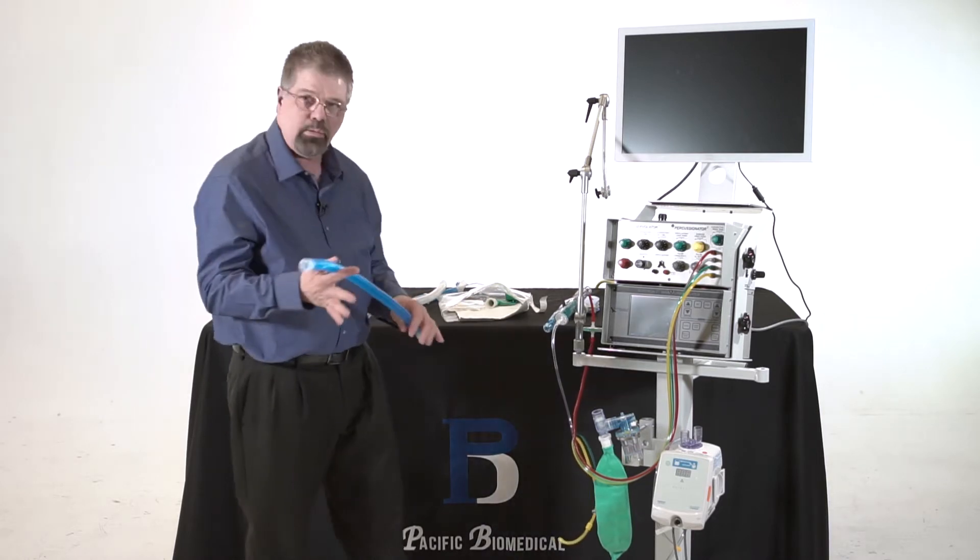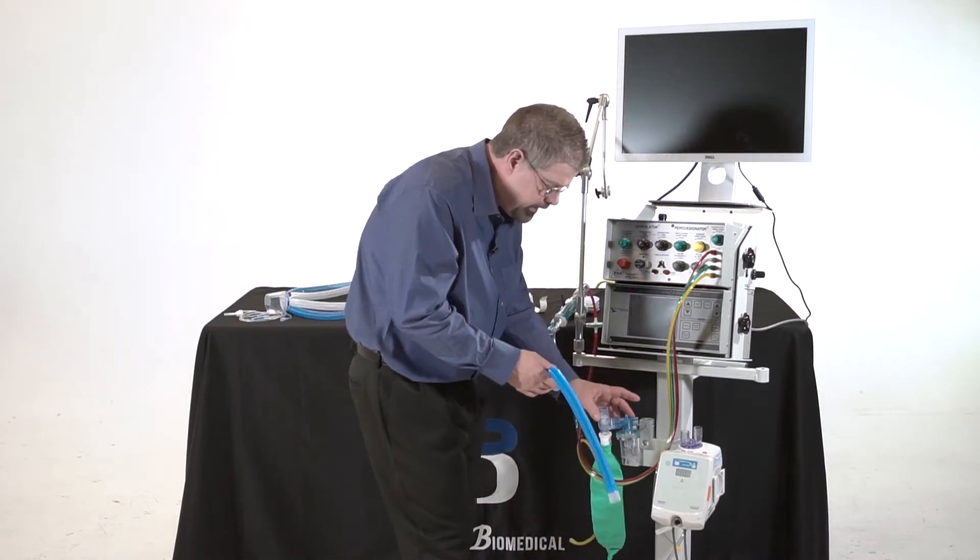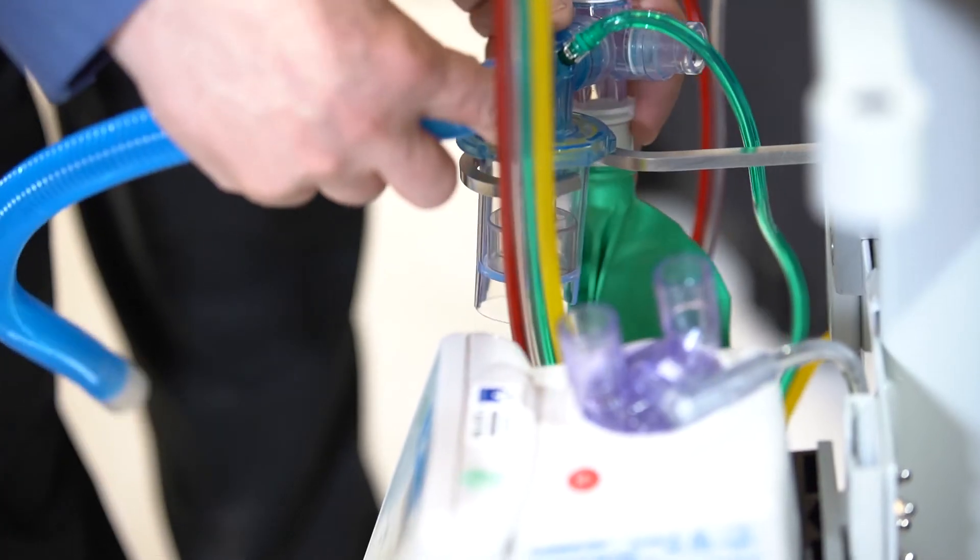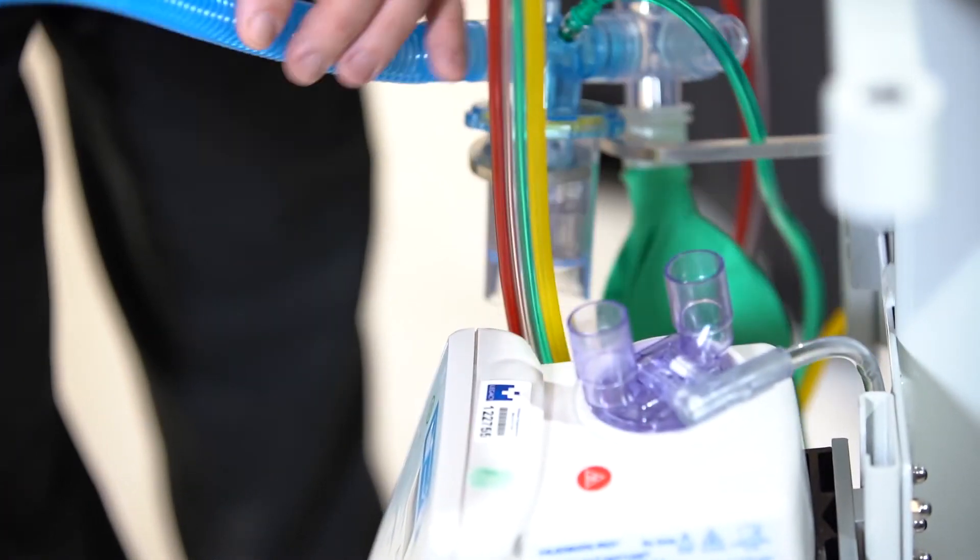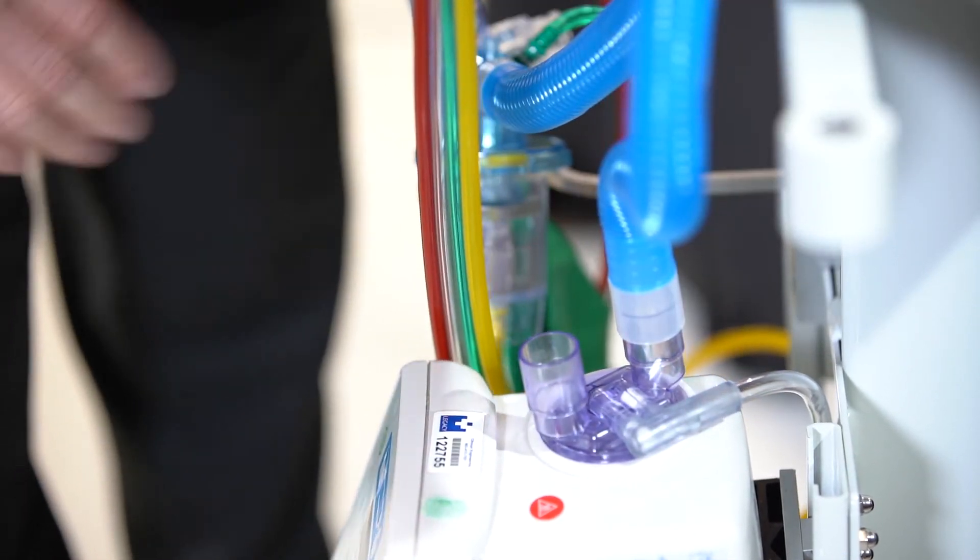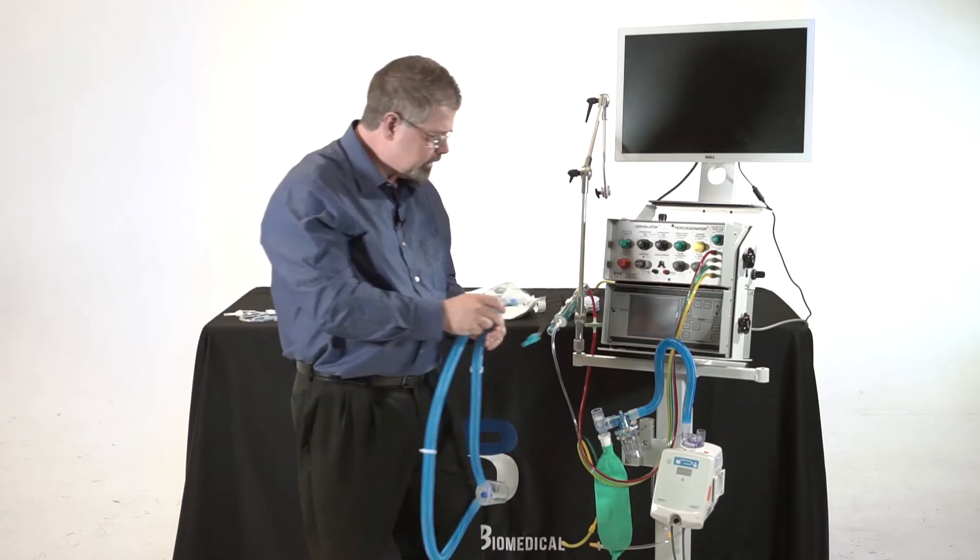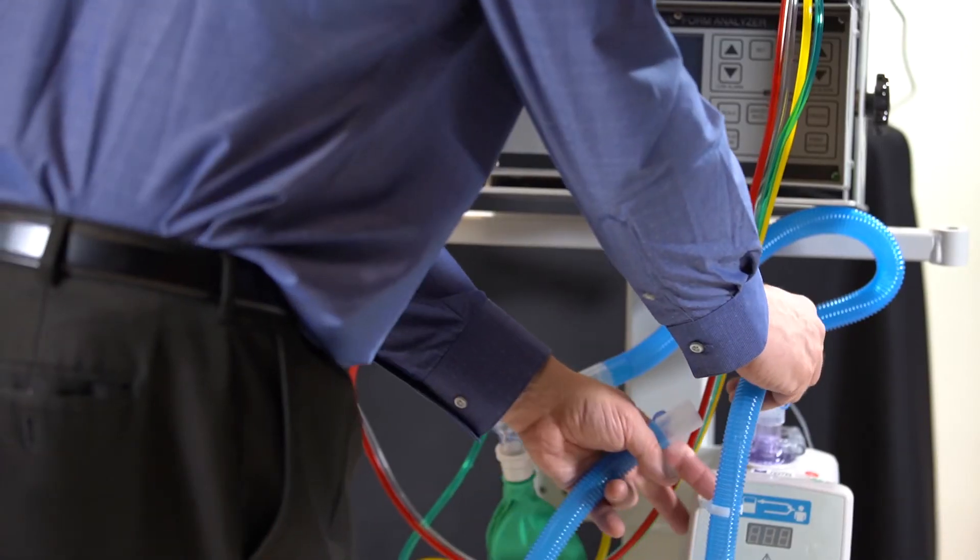We're all familiar with ventilator circuits. So I'm going to take this nebulizer, if you will, the blue piece of that, and I'm going to hook this up to this side of the humidifier. So I'm going to take this inspiratory limb and I'm just going to simply hook it up to the other side of the humidifier.